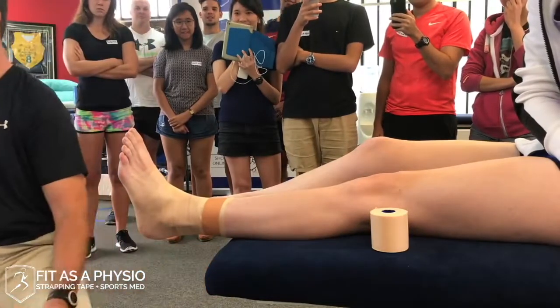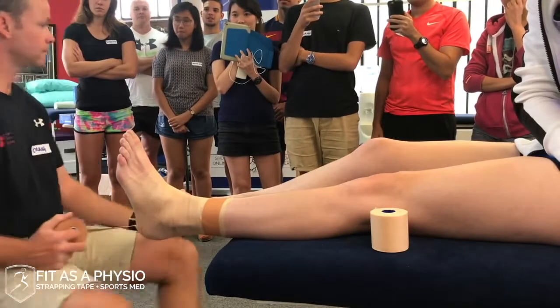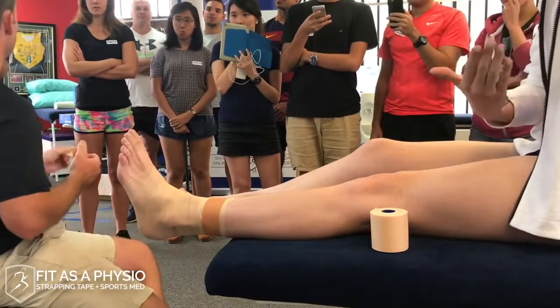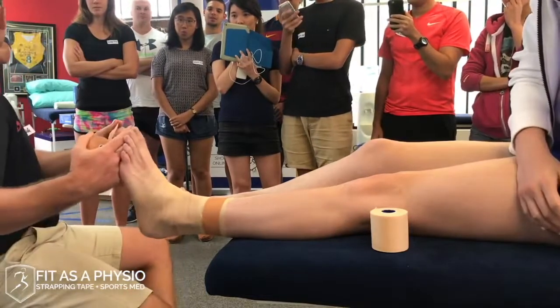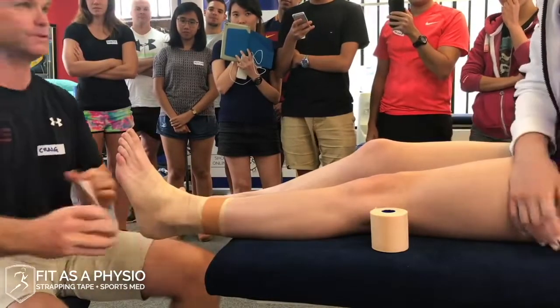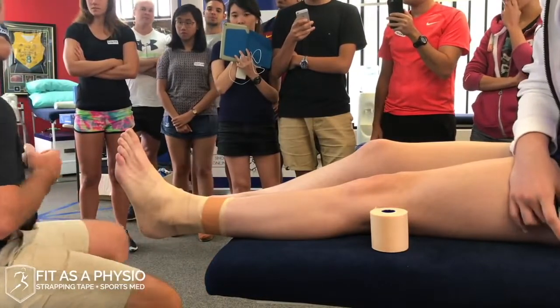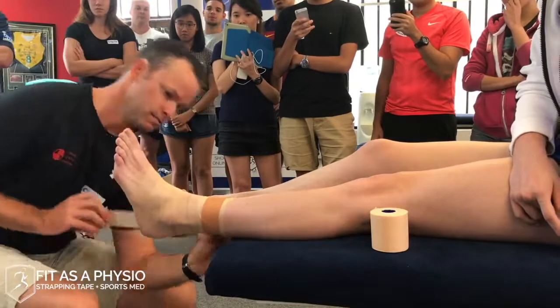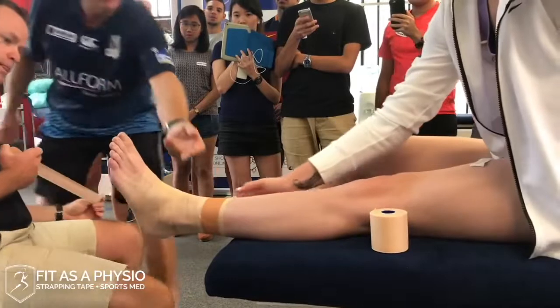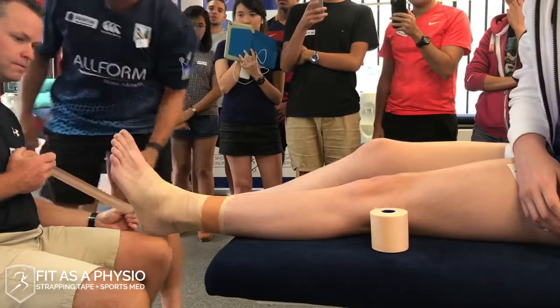For the stirrup, we start on the medial side because we're trying to restrict that lateral movement. We start medially and finish laterally. If we want to protect medially, we start laterally and finish medially. I start roughly at the level of the first anchor strap, then the next one overlapping.